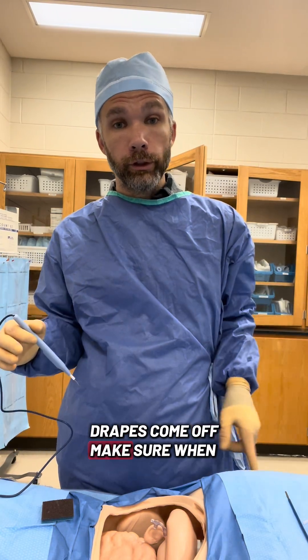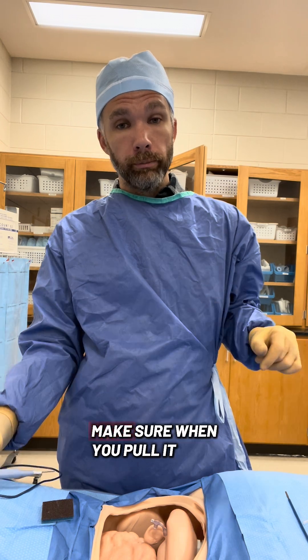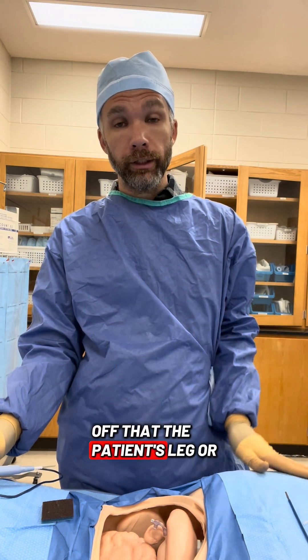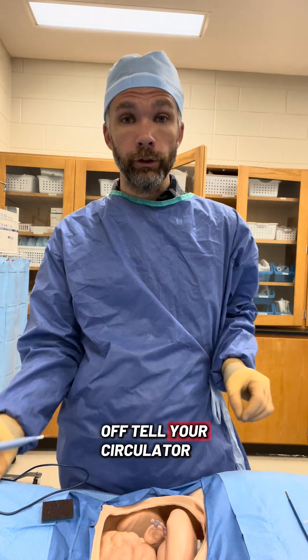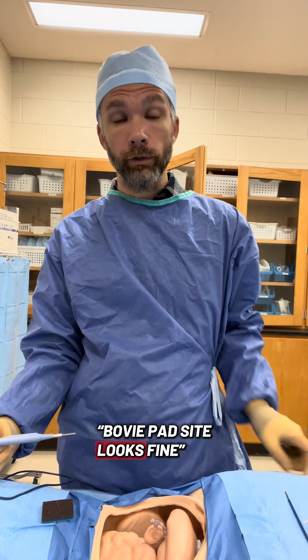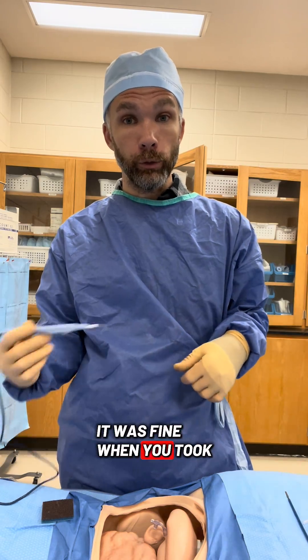Whenever you are done with your case, drapes come off. When you pull the Bovie pad off — it's like a sticky sticker — make sure the patient's leg, or wherever it is, is fine and there are no burns. Tell your circulator 'Bovie pad site looks fine' and let them know that you have checked it and it was fine when you took it off.